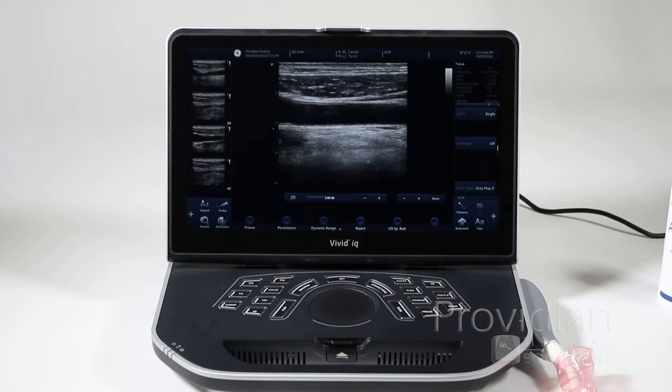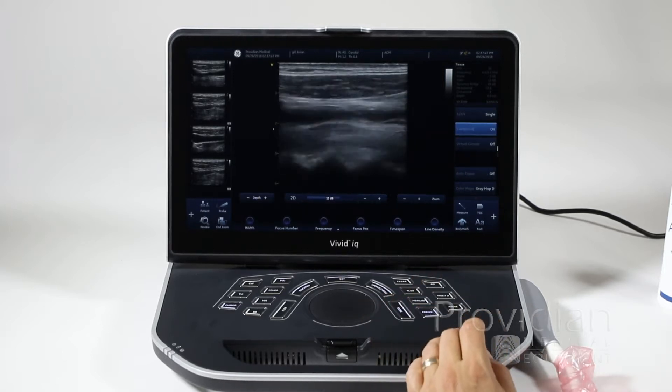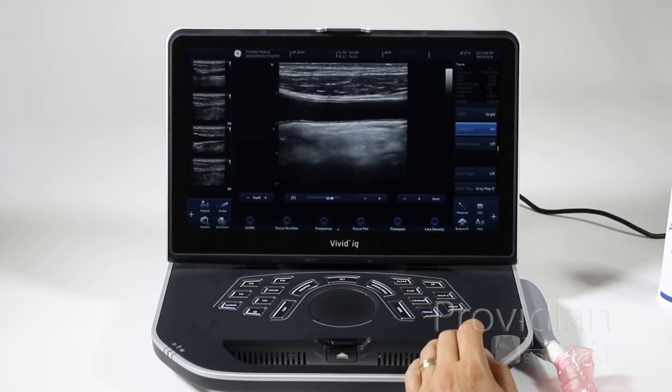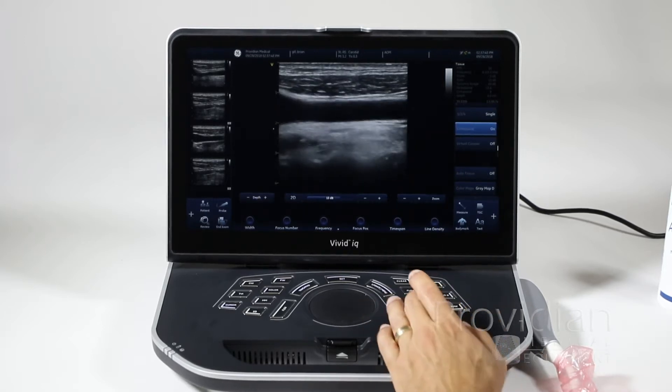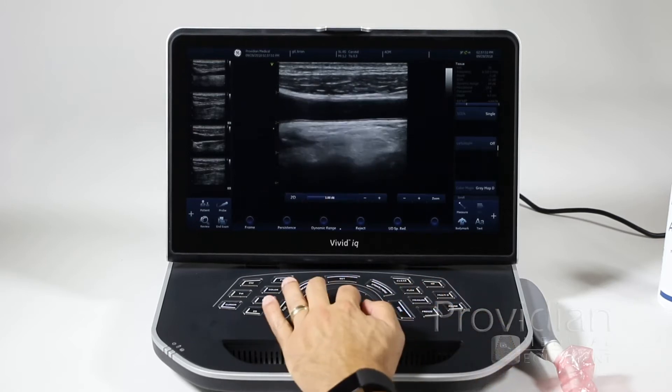Measurements and annotations are fairly straightforward on the system here. I'm going to unfreeze that image, get a quick shot, and then freeze.